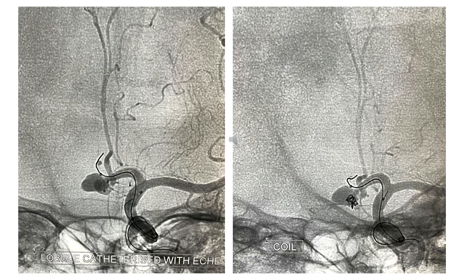So what I decided was that I will occlude this lobule which has ruptured. So I went with the Echelon. Now there are two microcatheters. The Headway is just parked here, and the Echelon is here, which is curved. The steam shaped microcatheter tip is there, and then I coiled this lobule of the aneurysm so that I had some safety of margin if I have to give some tirofiban or any other drug here.